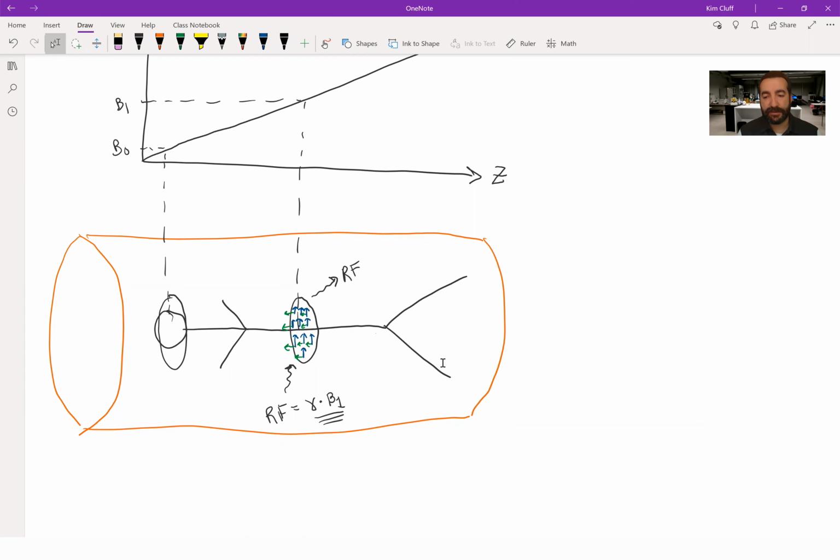In any image, in order to see anything in the image, if you don't have contrast, you won't see any difference between one pixel and another. If one pixel represents brain tissue, the other represents bone, they'll look the same because there's no contrast. You have to have contrast. And in X-ray, contrast comes from the different attenuation coefficients of the different tissue. Bone attenuates different than soft tissue.